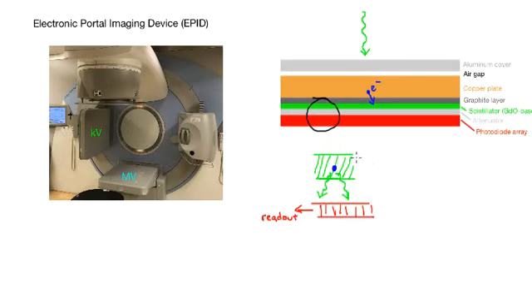Okay, now another thing that controls the signal is down here, what happens in the active layers, and also in the conversion. So you'll see more than one photon is coming out in the scintillator, and if you get more photons out, or better absorption in the conversion layer, then you're going to have a higher signal, right? So you can make this conversion area thicker. You can maybe make the scintillator thicker. You could change the type of material of the scintillator. That would give you more of these photons out, more signal.